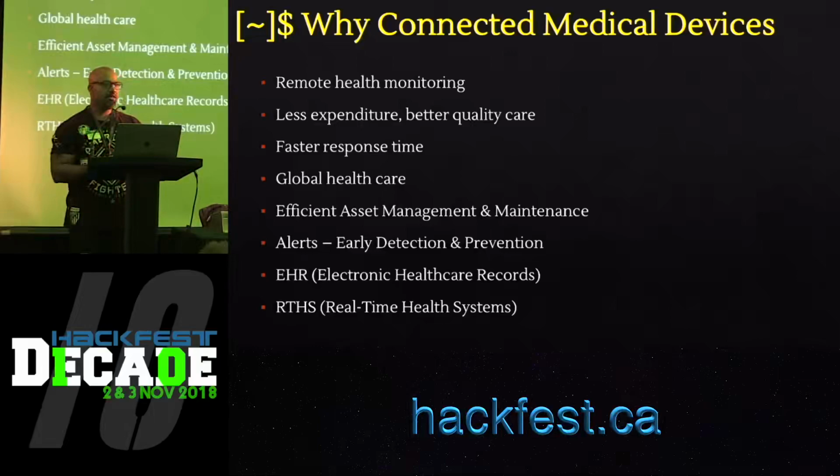So we did a whole iteration of fuzzing, trying out different messages, and with one of the combinations, we were able to retrieve this packet. If you look here, there are different parameters which are quite sensitive information: a drug name parameter, dosage, care area, caregiver information, patient information, location, route, site. You will see that all these fields are empty, but that's just because our infusion pump didn't have real data. In a real environment where it's deployed at a hospital, it will contain all that information. Once you receive that information, you can update it, fix the XModem checksum, and push it back to the infusion pump. We were able to do that.